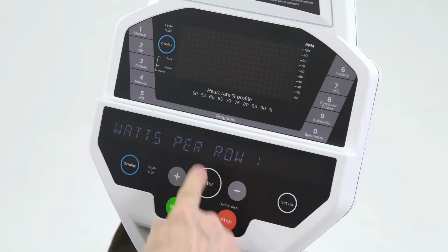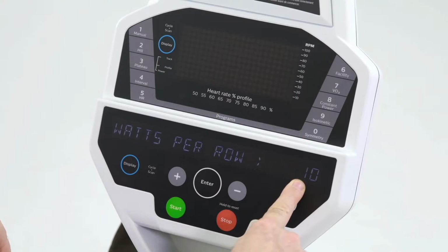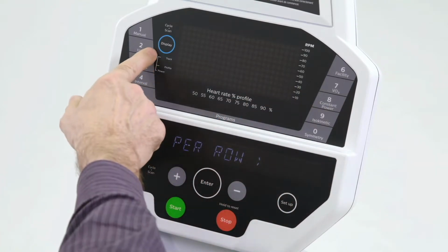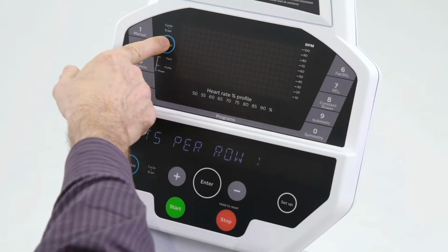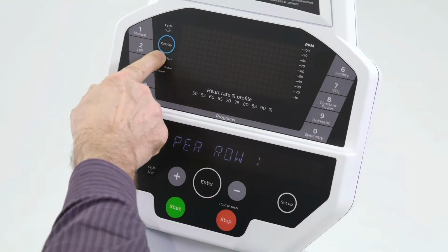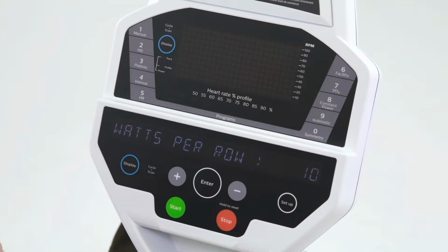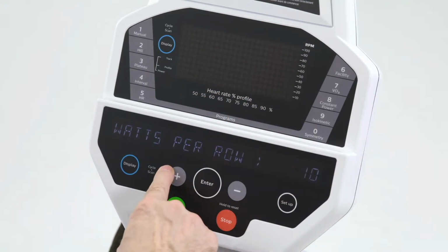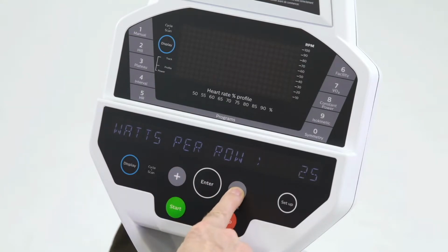The next function is watts per row. In here we set the default as 10 watts per row. We're talking about the rows of lights. So when we are in a program and we can see these rows of lights light up, we are allowed to select with both of these lights on. It'll show the power, so we'll be able to see the patient's power on the screen here. And right now it would be 10 watts for every row. You could set that all the way up to 50 watts a row, 100 watts per row, I believe, which is a little much, but you're allowed.